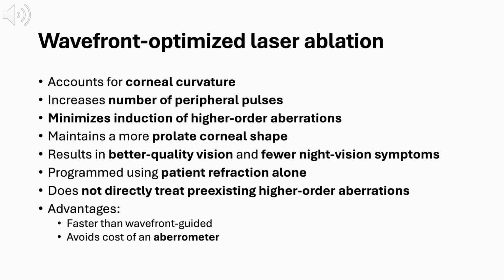Importantly, wavefront-optimized ablations are programmed using the patient's refraction alone. They are not designed to correct pre-existing higher-order aberrations, only to avoid creating new ones. That simplicity is also their advantage. Compared with wavefront-guided treatments, they are faster to perform and do not require an aberrometer, reducing cost and complexity while still improving optical outcomes.